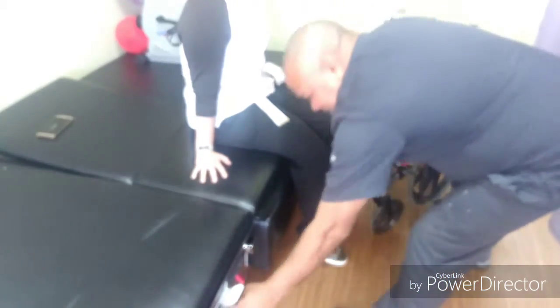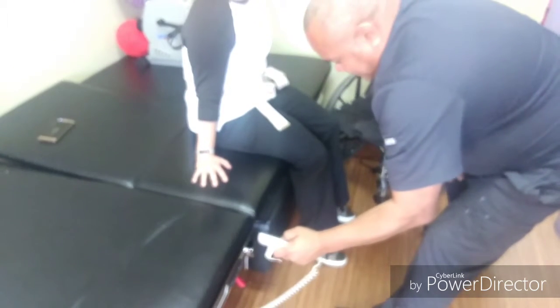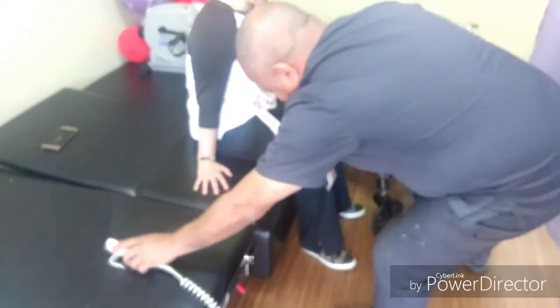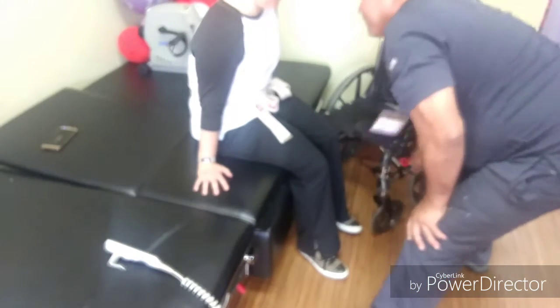Now, let's see. Depending on the bed, we're going to put the table down to where his feet are nice on the ground and flat. Okay? And I want his ankles turned towards the chair. How you feeling, Fred? I'm good.